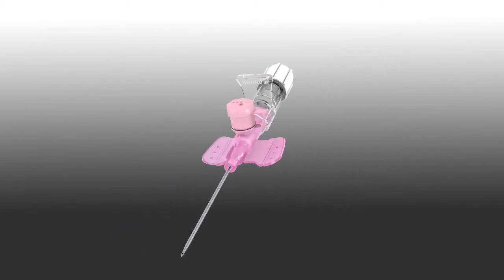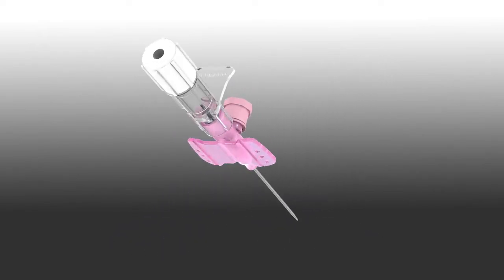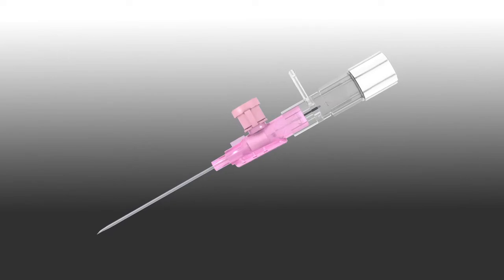This is an IV catheter with passive safety technology. Safe and easy to use, resulting in first-stick success.